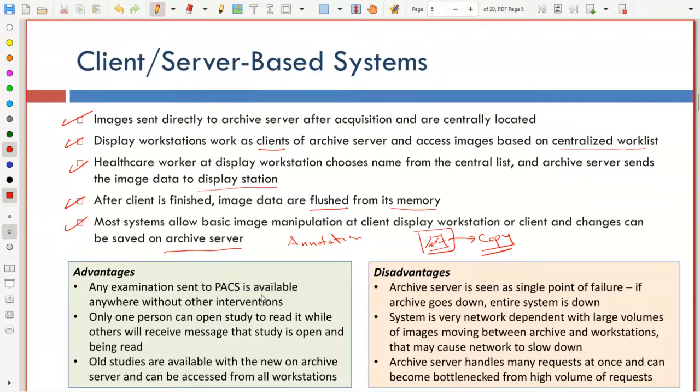If you have, for example, many cases in CT, then most of the workstations can work on CT. If next day you have more cases in MRI, then most of the same workstations will be working on MRI. So you can adapt the same number of workstations to deal with the flow in any one of them without any problems.